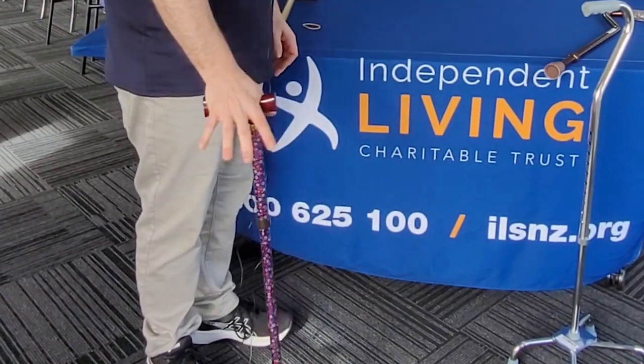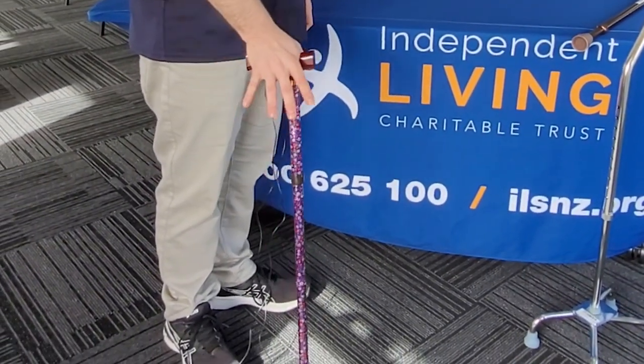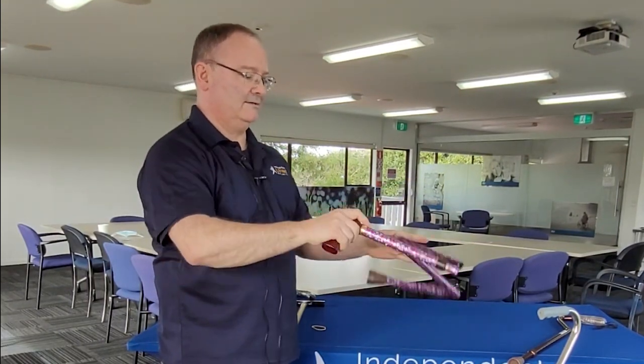Then as you're walking along, if you see somebody you know and you don't want them to know you've got a walking stick, you can very quickly fold it, put it behind your back, wave them on their happy way, and then you're ready to go.